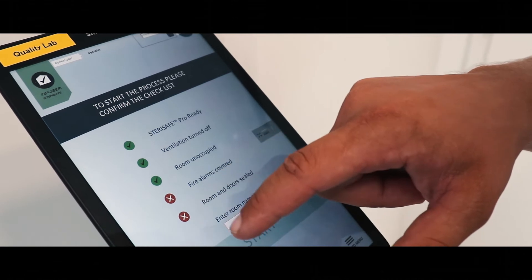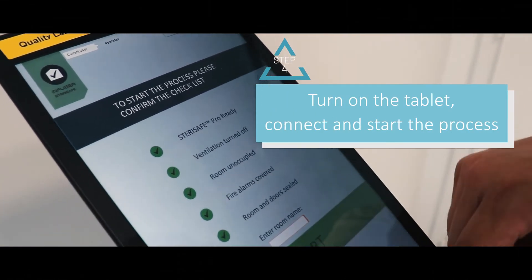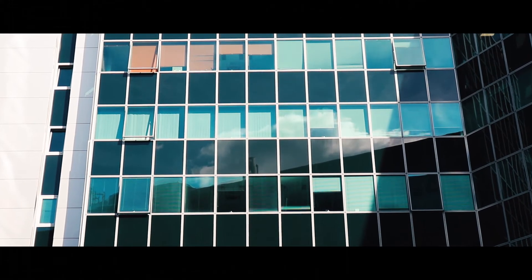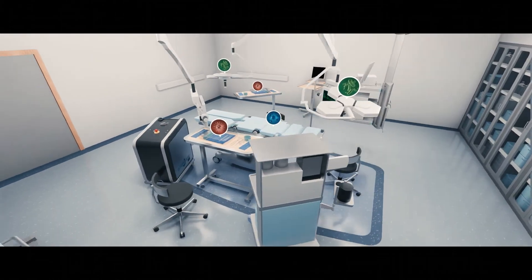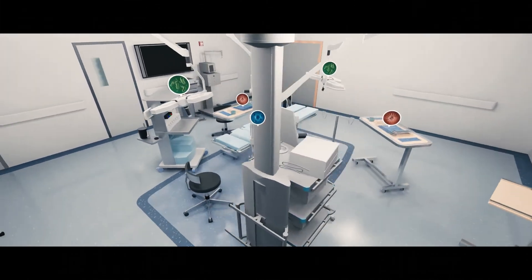Step 4: Once you are ready to start the process, turn on the tablet and connect via your unique login and start your disinfection process. Once the start button is pressed, the disinfection process will begin to eliminate all harmful pathogens present in the room.